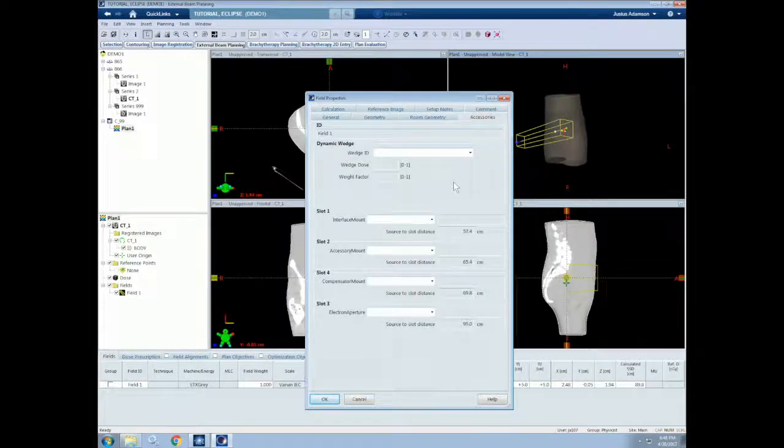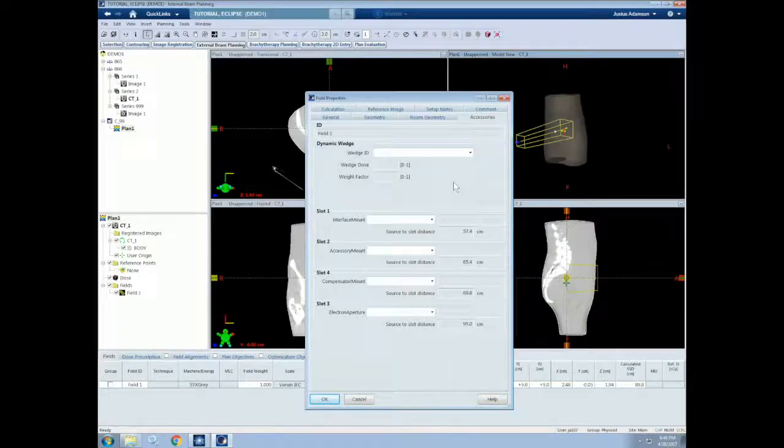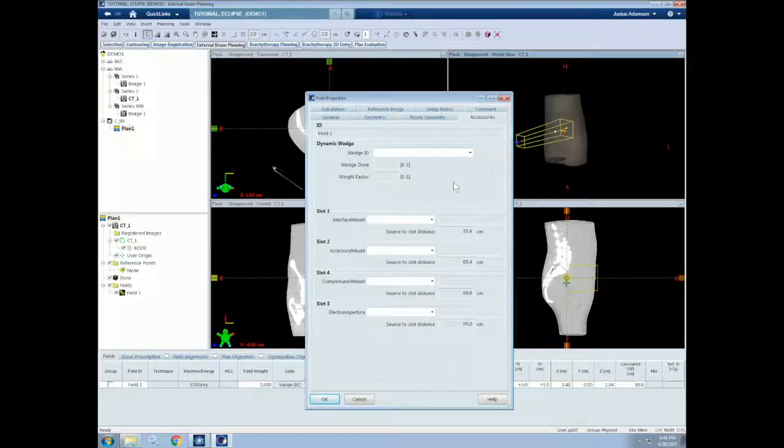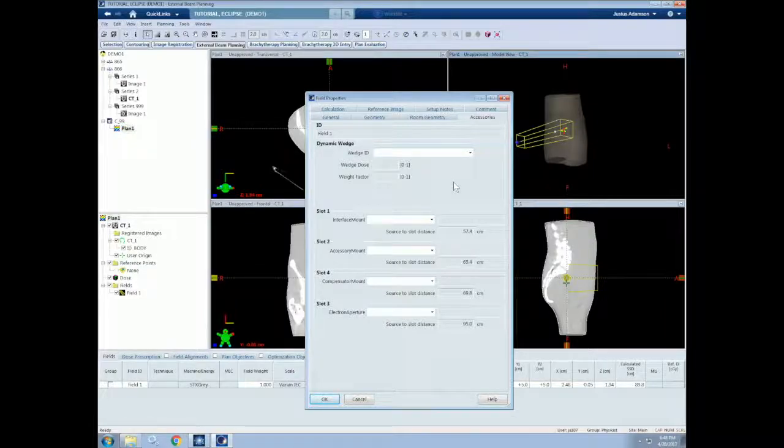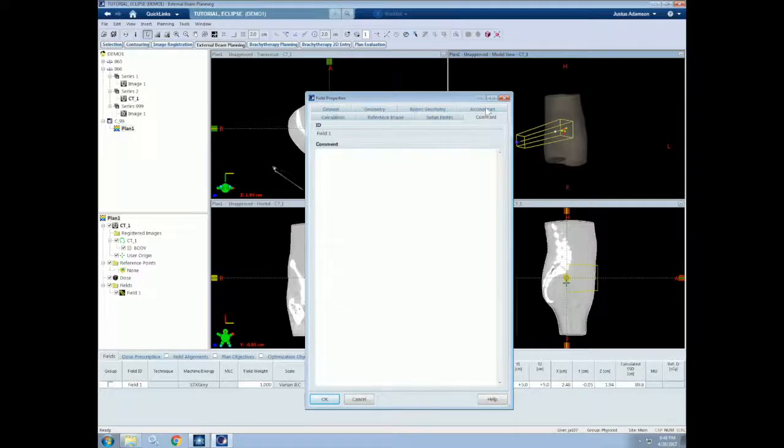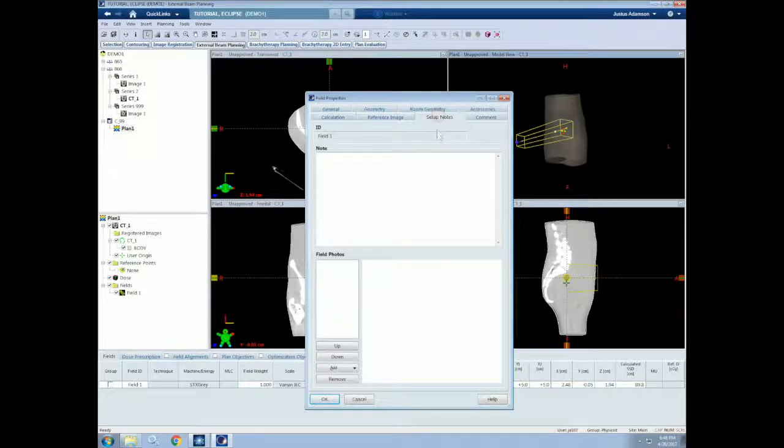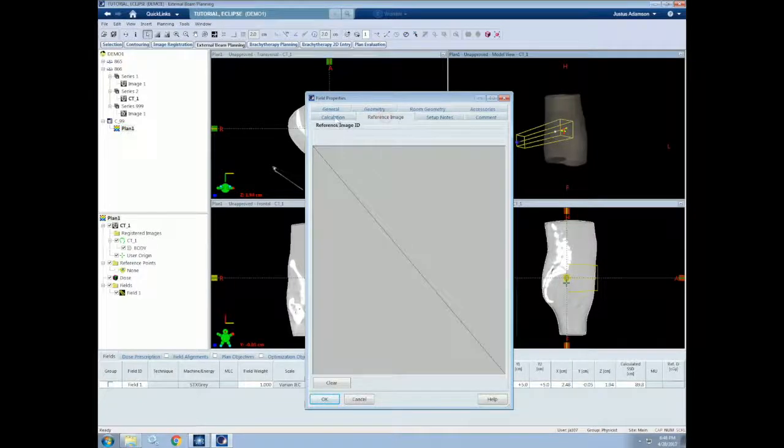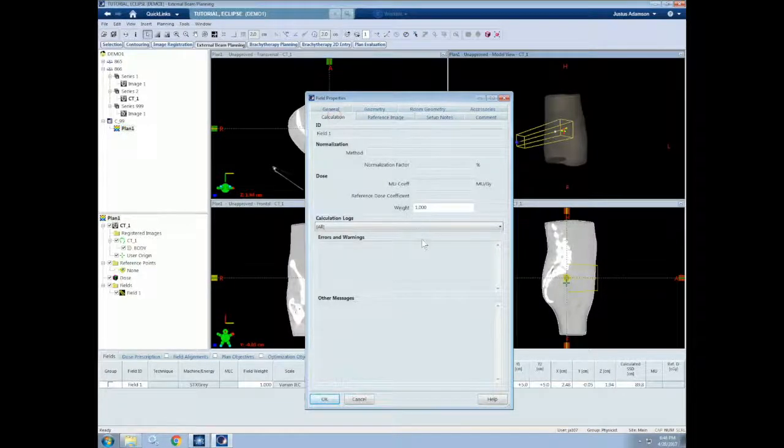We can also change the specific room geometry information. This includes the couch and the imager parameters. If we want to use an accessory for a beam, we can choose that here. These include wedges, cutouts, SRS mounts, cones, blocks, trays, compensators, and more. All accessories that are commissioned for the current treatment unit will show up here. We also have room for comments, setup notes, reference images, and calculation information. So this includes the beam weighting.